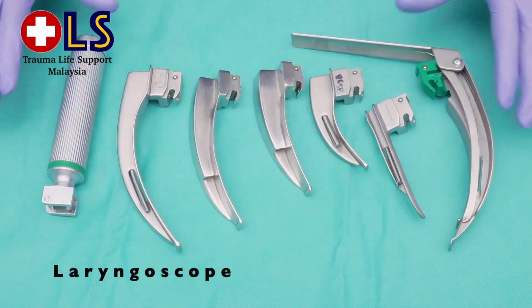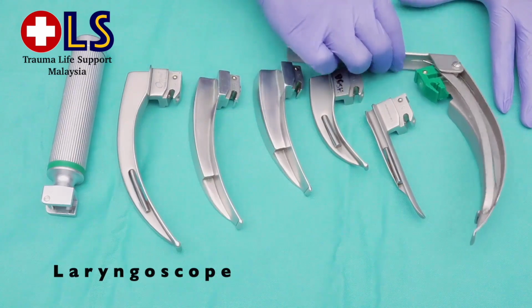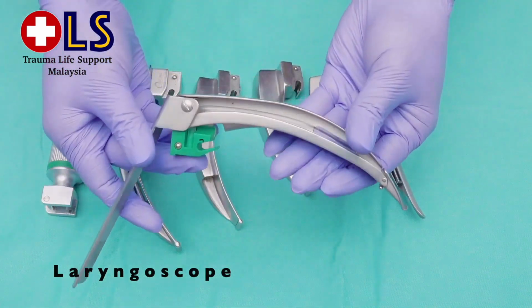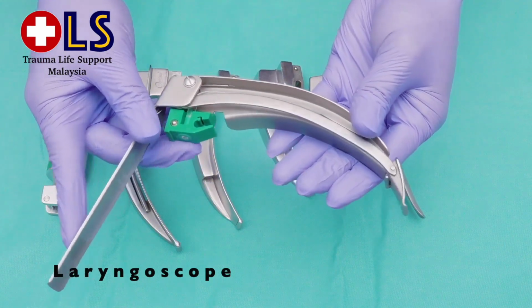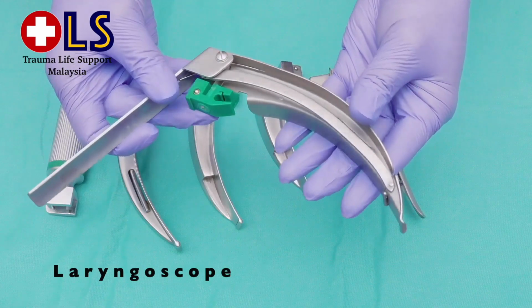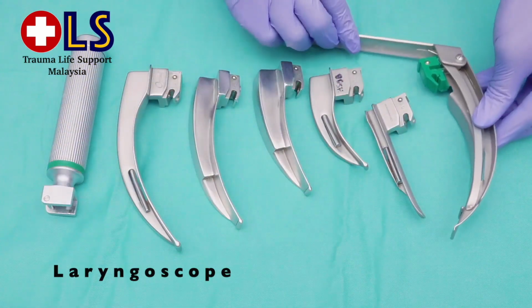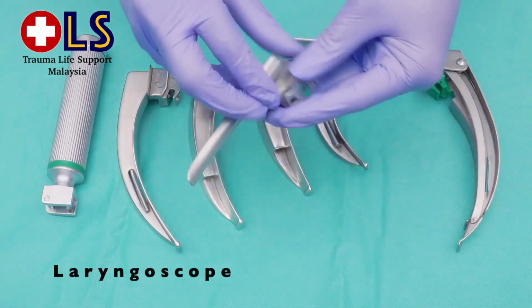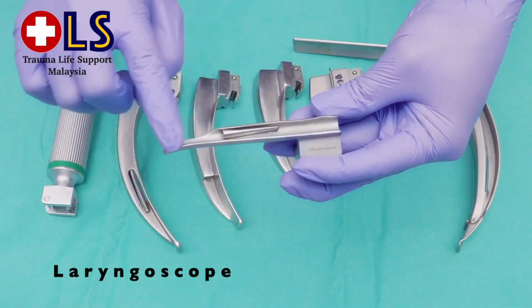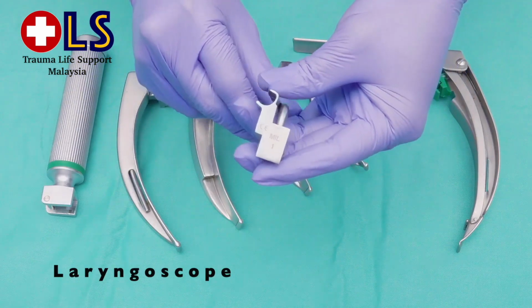This is a McCoy blade. It has a movable distal tip to lift the larynx forward. This is straight blade for children. It has size from size 00 until size 4.